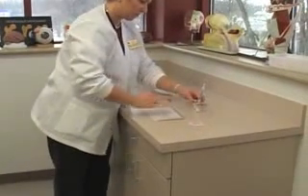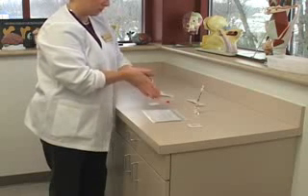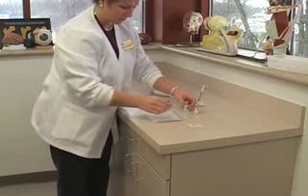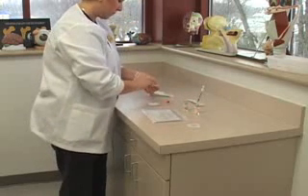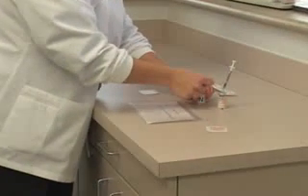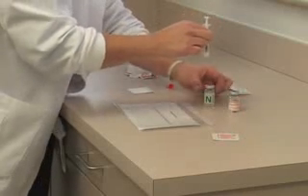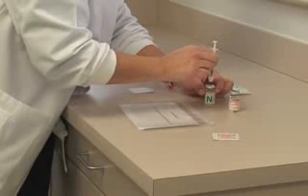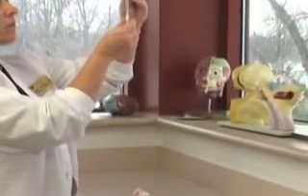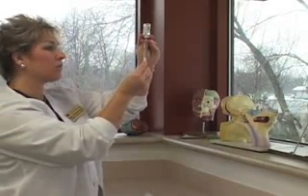Holding the cloudy vial horizontally between your hands, thoroughly roll the vial to assure the solution is in suspension. Clean the rubber stopper of cloudy insulin vial with a new alcohol wipe. Remove syringe from vial of clear insulin and insert the needle into the cloudy insulin vial. Invert the cloudy insulin vial and withdraw correct amount of insulin, being careful to withdraw the exact amount.